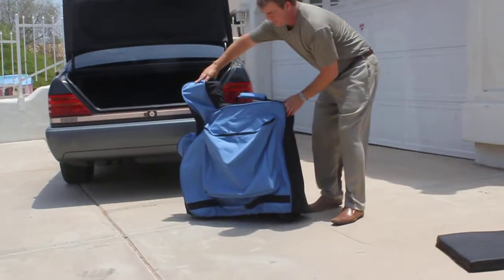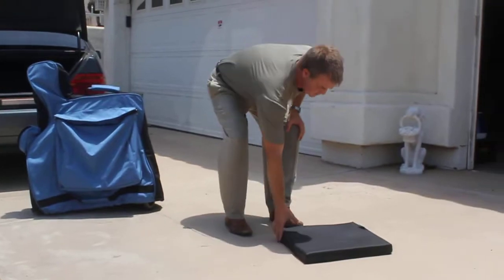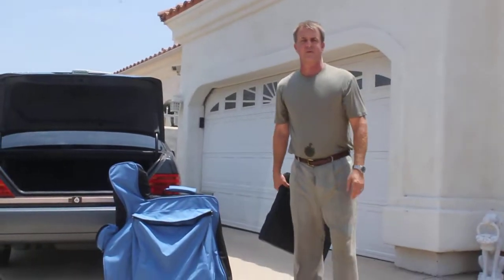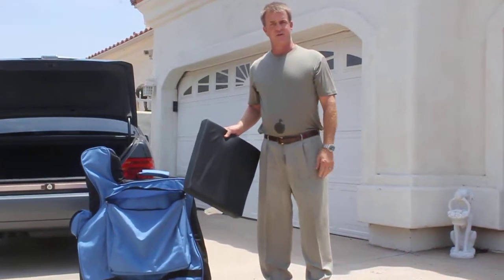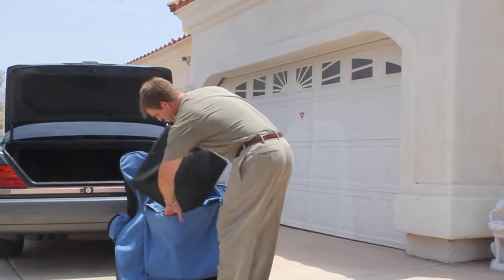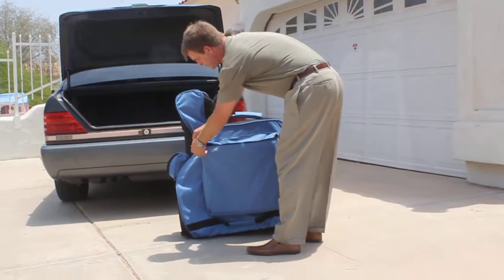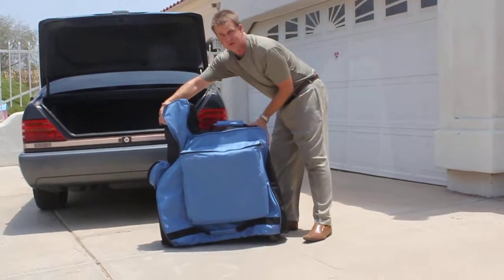On the other side is for your cushion. Wheelchair cushions can go from anywhere from $100 all the way up to $1,000, depending on what you're using. This will take a one and two-inch cushion all the way up to a four-inch cushion. Slips right in here. It also adds protection to the wheelchair itself when you're traveling on the airline.